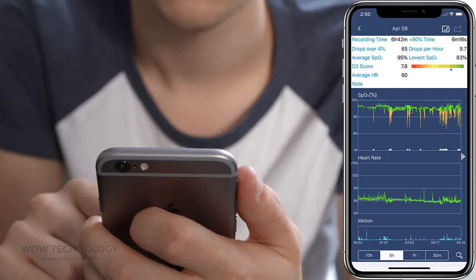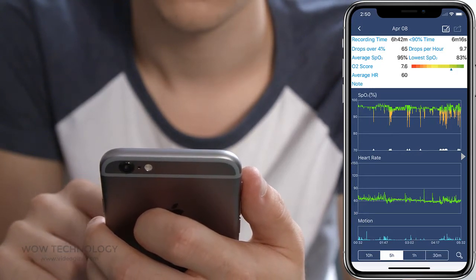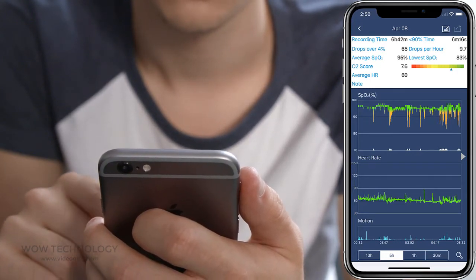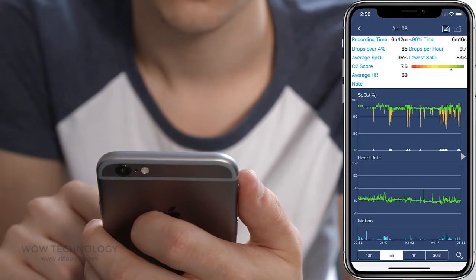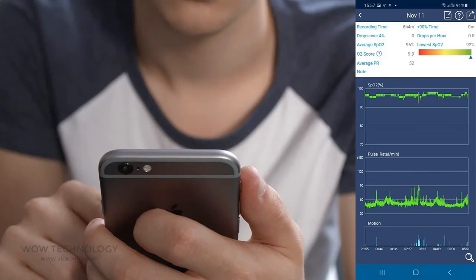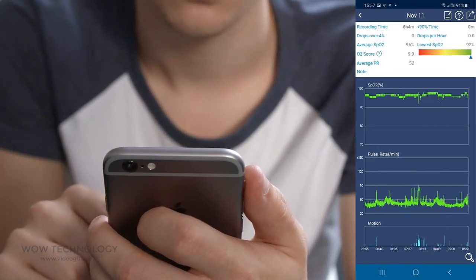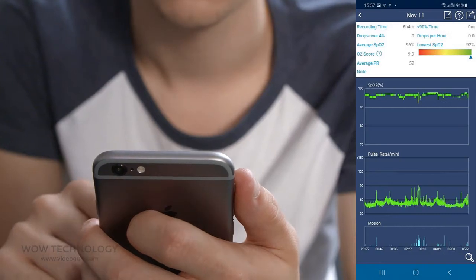From the History tab you can see your previous data of blood oxygen levels, heart rates and body movements. The report shows how long your oxygen is below 90%, and how many times during a night your oxygen drops over 4%. You can also zoom into the chart to see more details, such as the exact value when a drop happens.